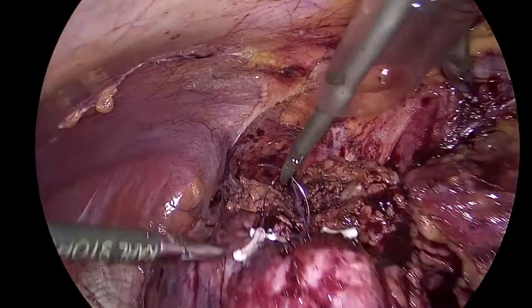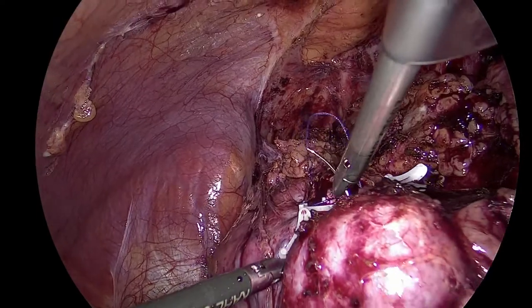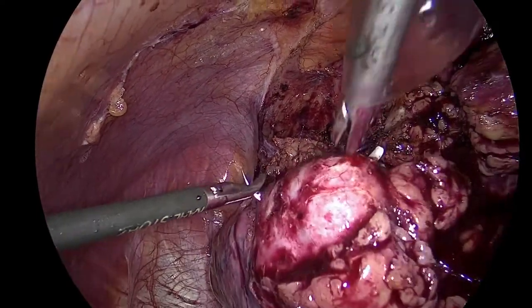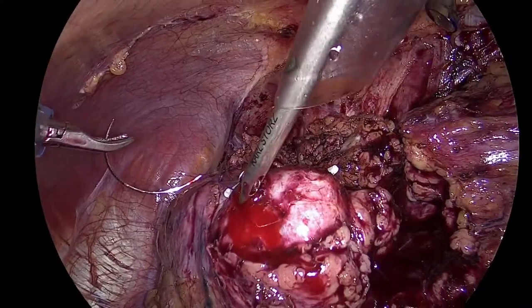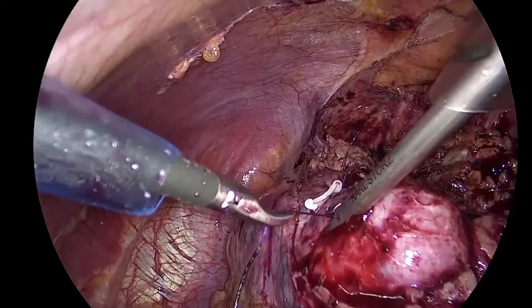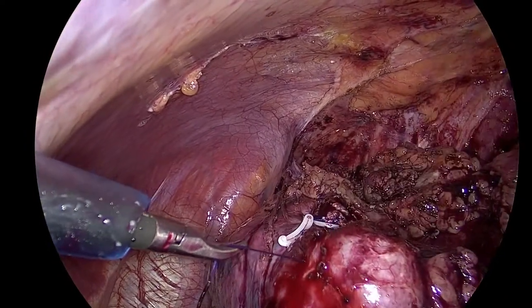Come in. The suture was 15 centimeters. Normally, that's the length you cut it, so you don't need to go in and out all the time to change sutures. Come in. Prepare a clip. Again, you pull, you push in with your needle holder. It keeps the memory sometimes, eh?